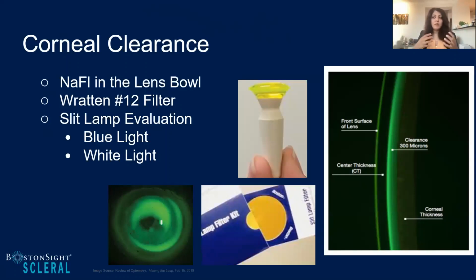When we start with just the initial putting a lens on the eye, if you put a little bit of fluorescein into the bowl and then put it on the eye, that makes it really helpful for you to be able to take a look at this central vault. With the fluorescein, having a Wratten filter in there makes it a lot easier for you to see the different zones, and it helps you to really bring that fluorescein to help it pop.